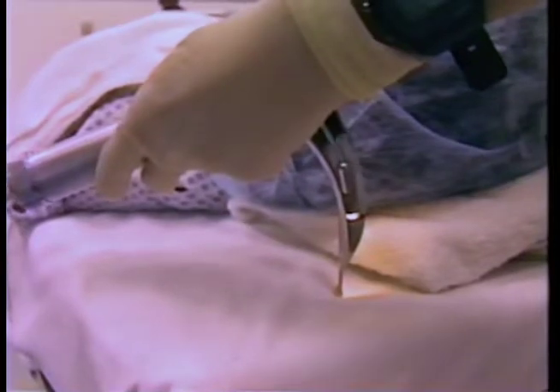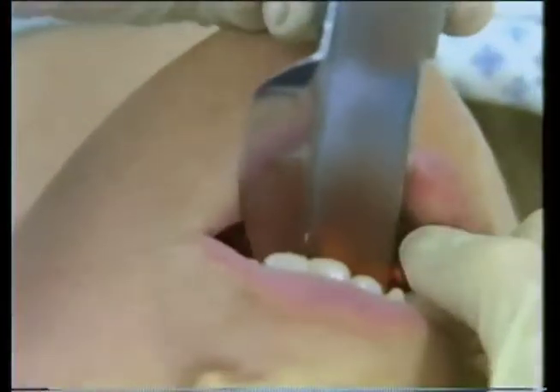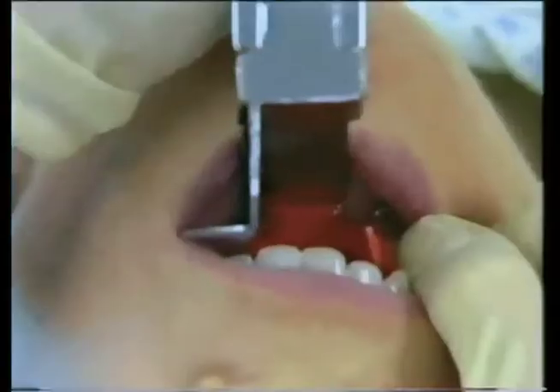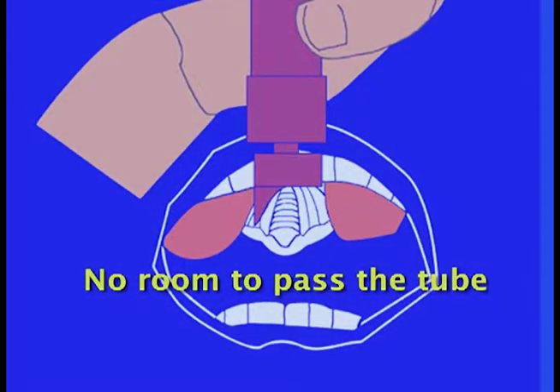Grasp the handle in your left hand with the blade down and pointing away from you. Insert the blade to the right side of the mouth and tongue. Control of the tongue is key. Placing the blade in the middle of the tongue can cause the tongue to block your view and leave you with no room to pass the tube.